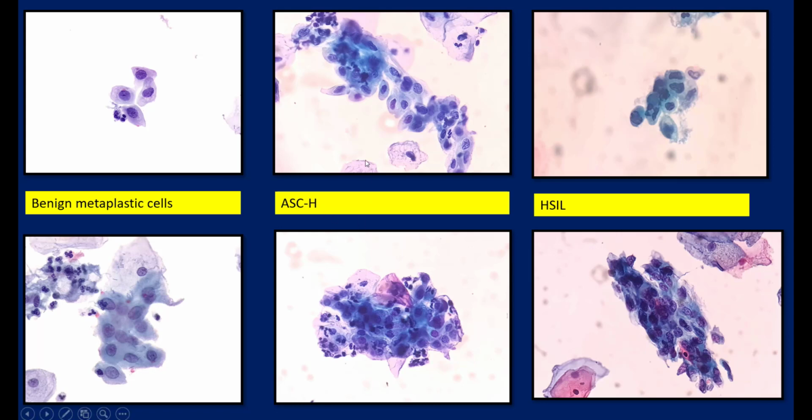These are the pictures which you have seen before, I guess one or two of them. These are metaplastic cells, a little bit disoriented, a little bit of overlapping, chromatin a little bit more irregular, right? Some degree of nuclear membrane irregularities. So these are the cases which I'm not really confident enough to put under the category of HSIL.